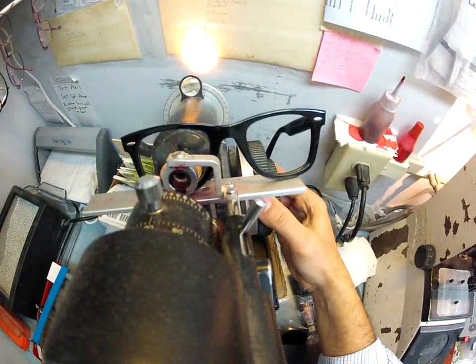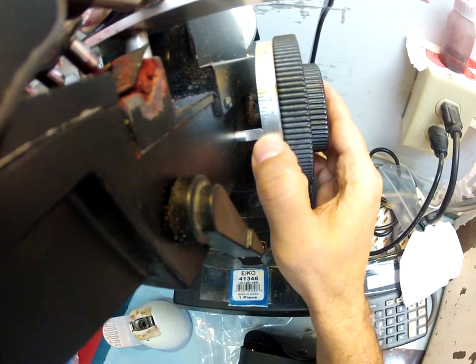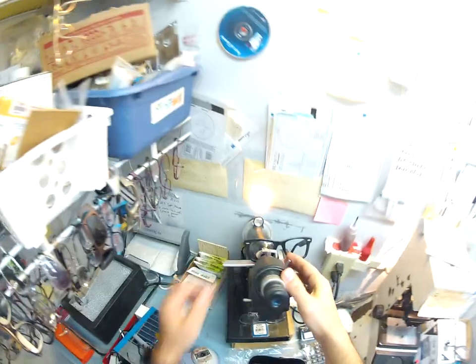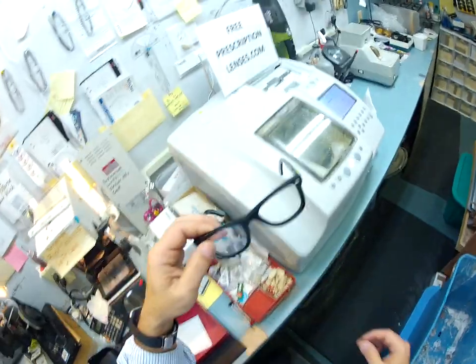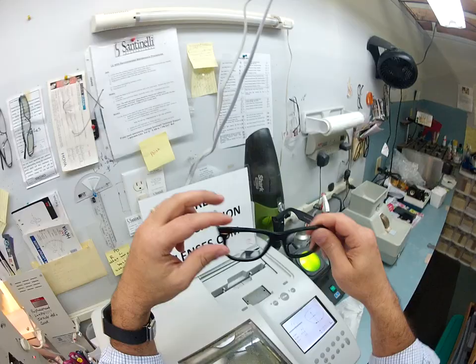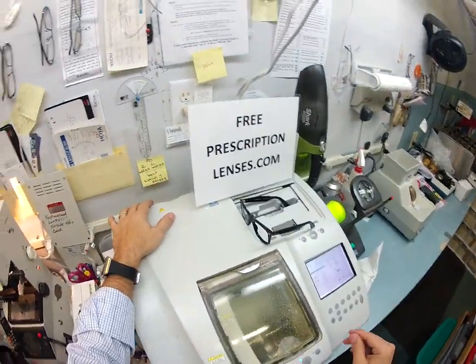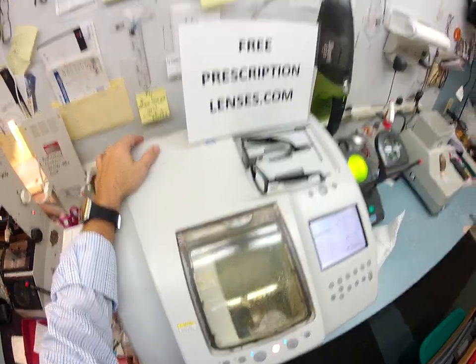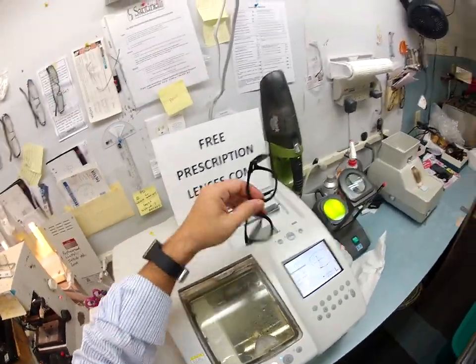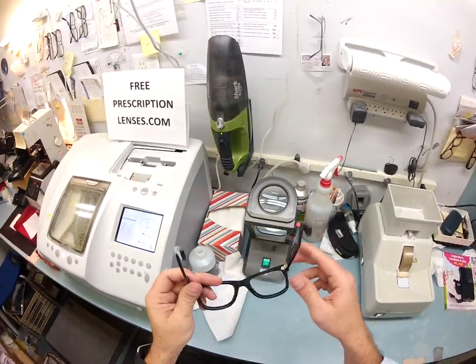I'm going to test the bifocal strength — I get a plus 1.75, which is correct. Everything's in quarter increments: 1.25, 1.50, 1.75, and 2.00. That is done. The nice thing about this frame is it will last you for years and years. I can always cut just lenses and ship them to you, and I can show you how to pop the lenses in and out should you ever need other lenses.